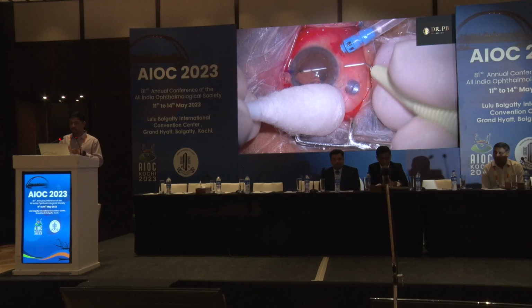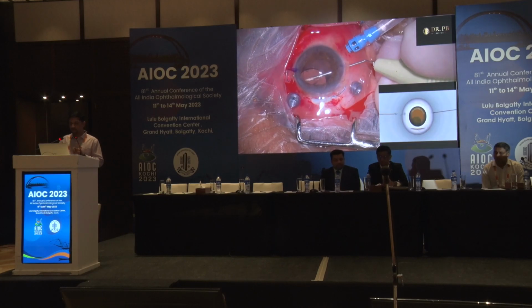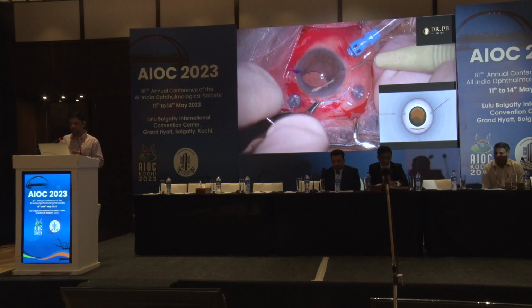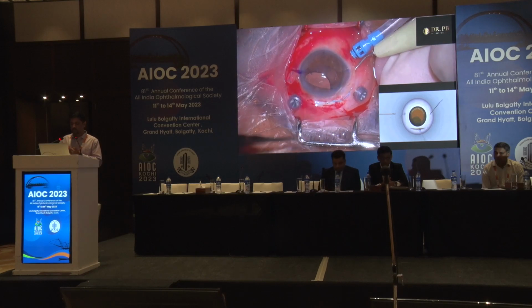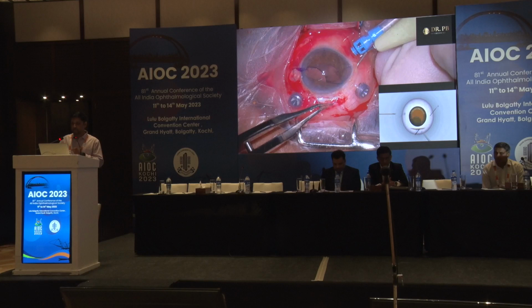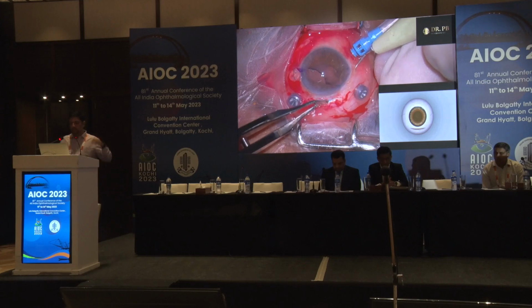Enter and change the direction of the needle. You can use McPherson forceps to gently depress and do a sweeping motion and bring the tip of the needle outside. This XNet device also has scleral markers on the other side, so you can exactly measure 1.5 mm. As you can see here, now I'm retracting the trailing haptic and just docking it. Depress the needle slightly at this point, like how an aircraft would land on a runway.